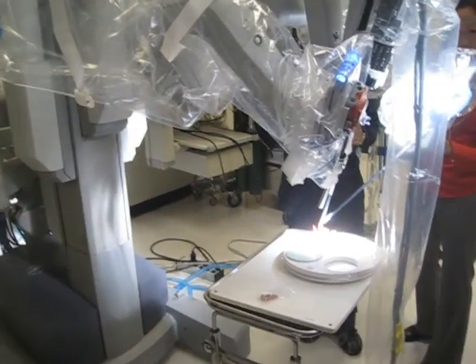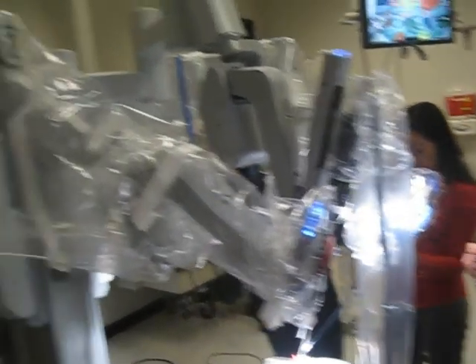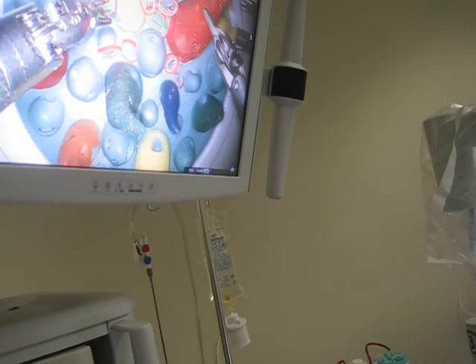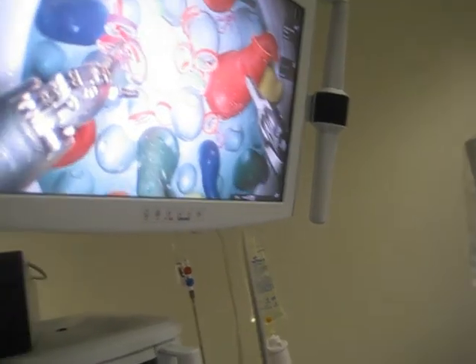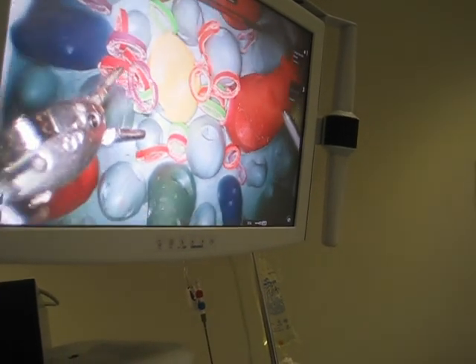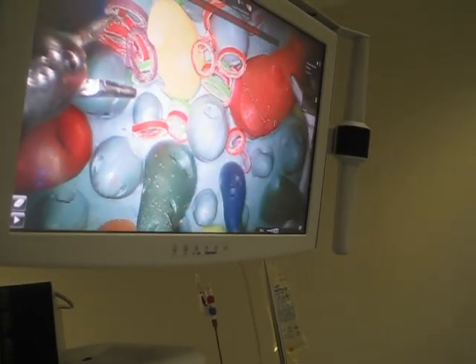Now twist the hand grips that you've got and bring it in and out of focus, with your foot on the camera pedal. So you're not pulling anymore — you're now twisting those hand grips in place, and you can bring it in and out of focus.